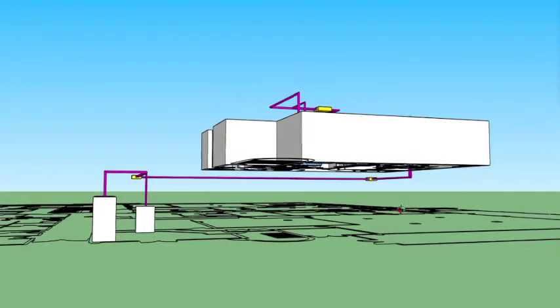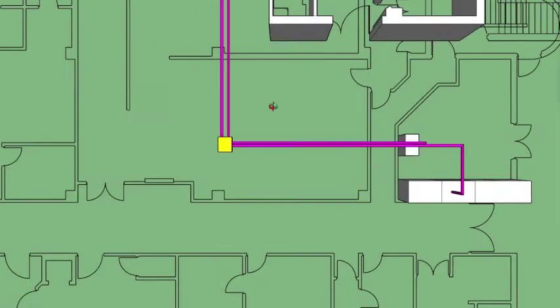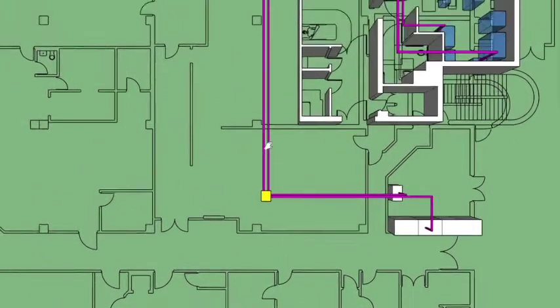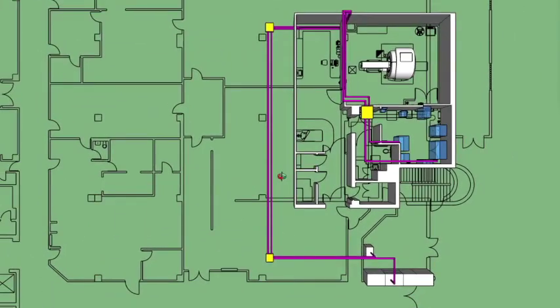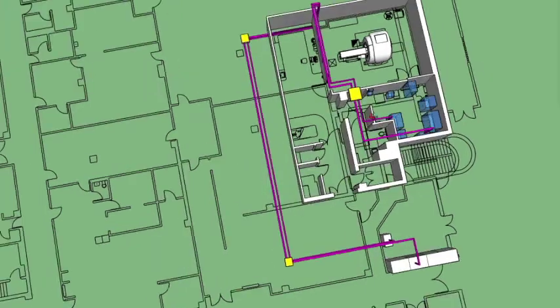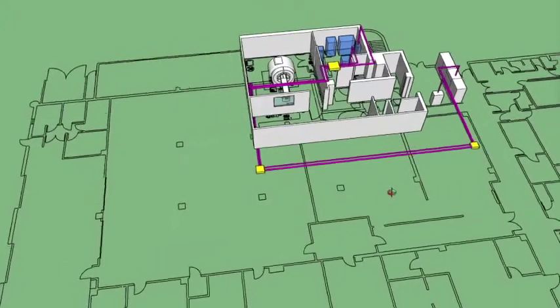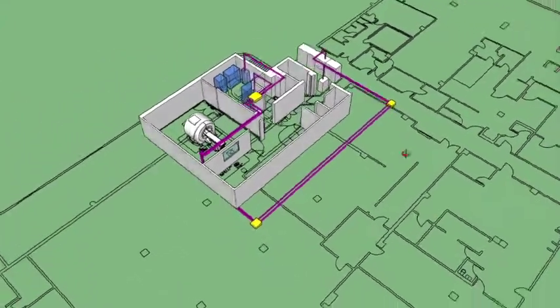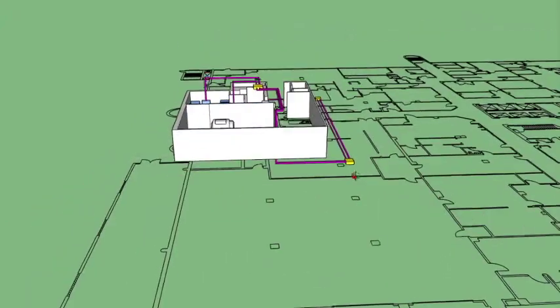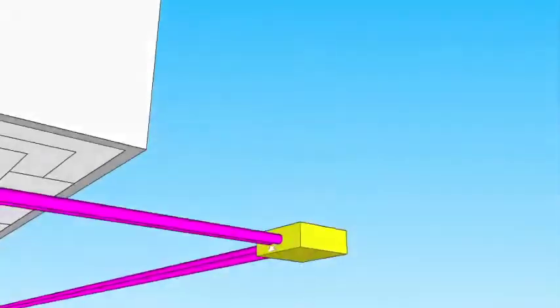So, if there ever is a time when facility needs to pull something again, or just future construction, these pull boxes will still be available and can be referenced here. Caffey Incorporated recommends that a qualified and competent facility or maintenance personnel be the one to tamper with or change these pull boxes for the future.